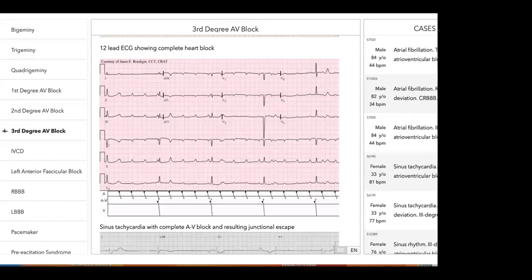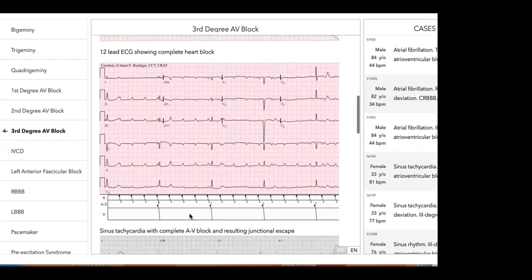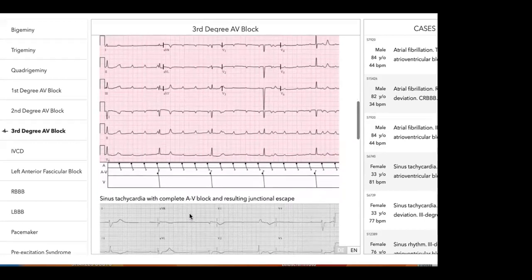A long-time ECG is basically an ECG that records the events for a maximum of 24 hours. And once you have a record within 24 hours, you can analyze it. How many of such incidences do you have? And mostly, if you see this, even without doing this long-time ECG, you would recommend implantation of a pacemaker.